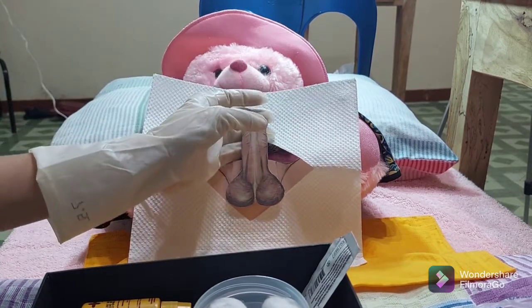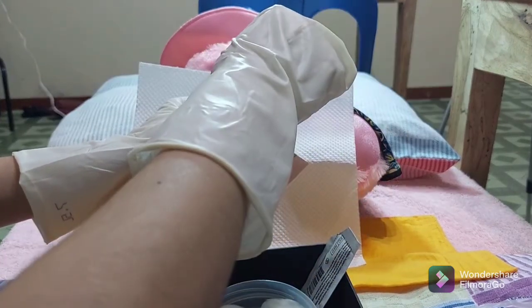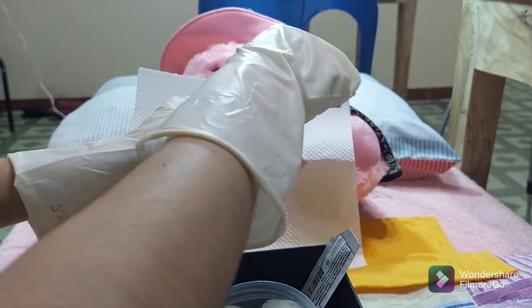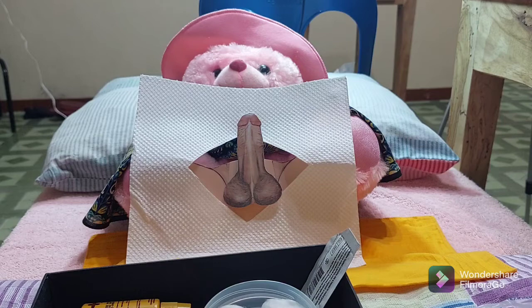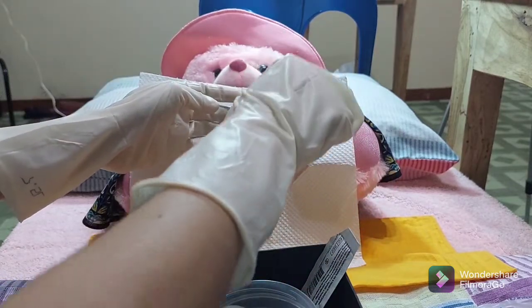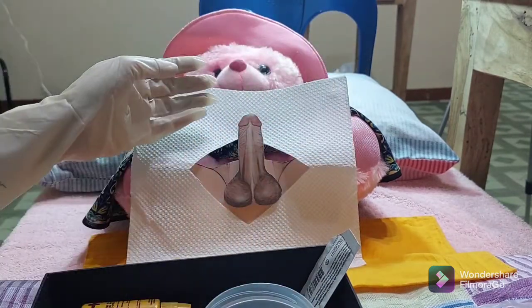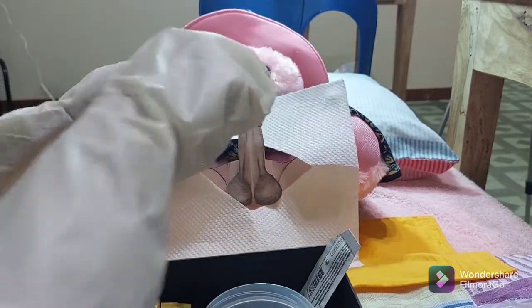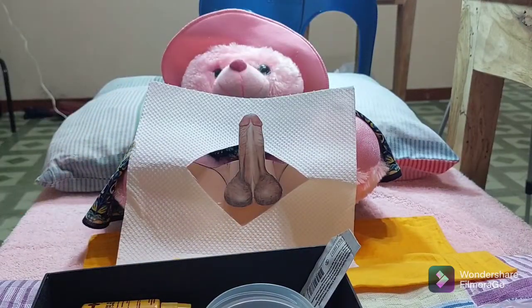Using sterile technique and the dominant hand, clean the urethral meatus in a circular motion, working outward from the meatus. This maintains sterility of the catheter.